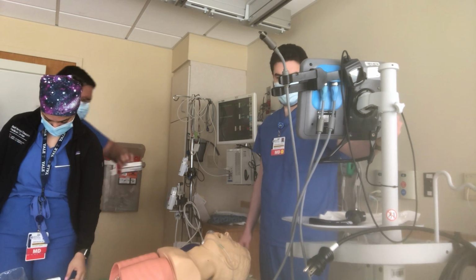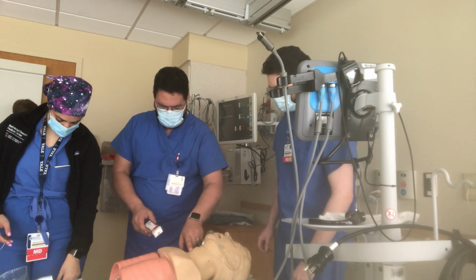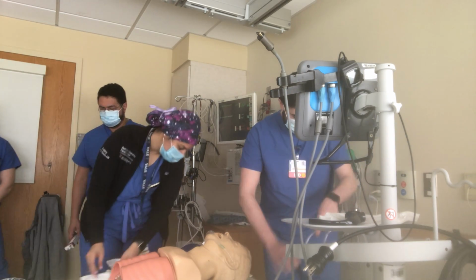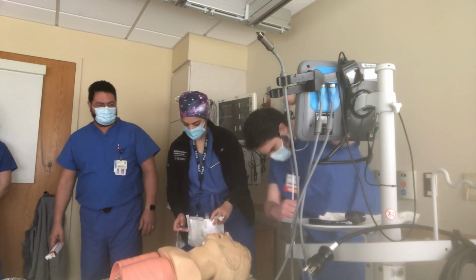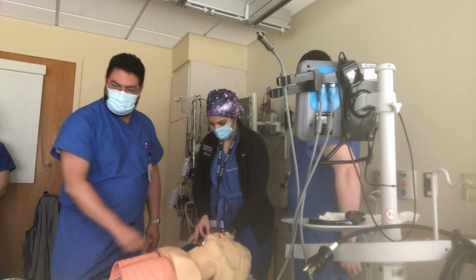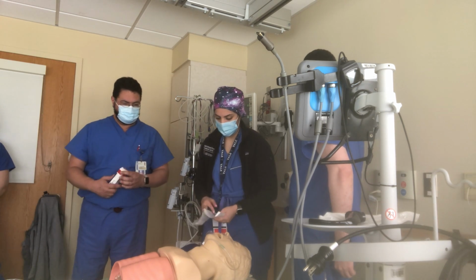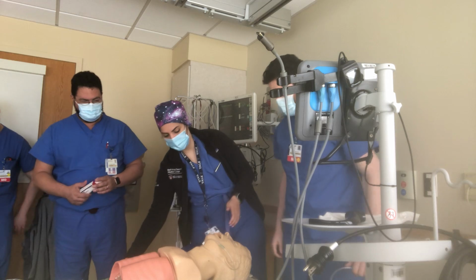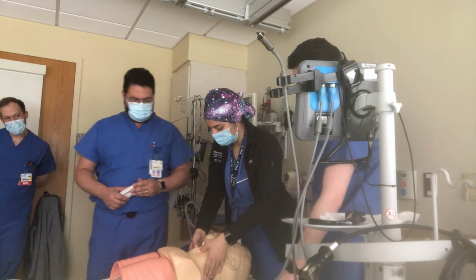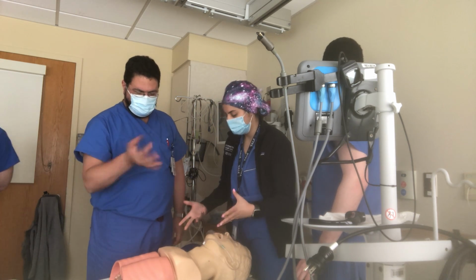All right, so here. The first thing you do is this. I'm gonna use this because you can't puncture here. So come close to us here, stay next to our professor. Right? So how do you find the cricothyroid membrane? It would be right below where I would think the thyroid is. Yep. But I can't really feel any landmarks on this. So you're not gonna see landmarks.